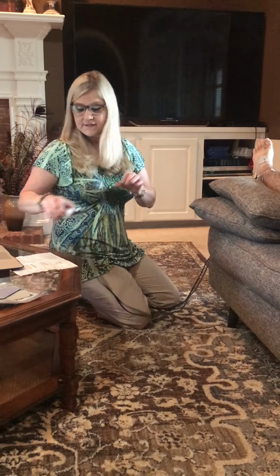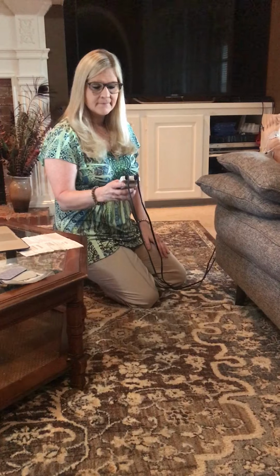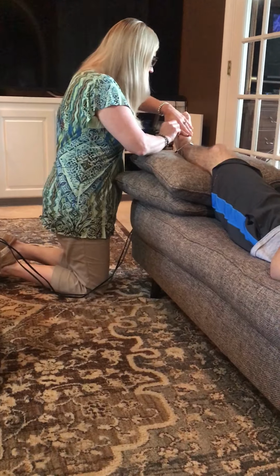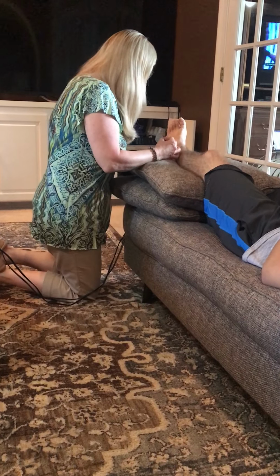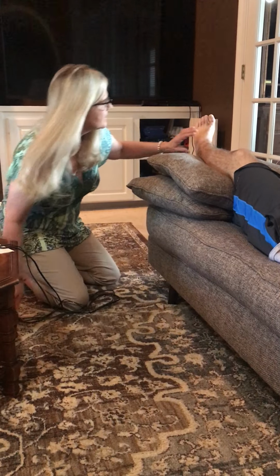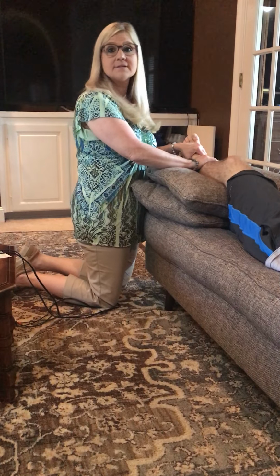So then leave him with the call button. Treatment's over. I'm going to turn the intensity down on my machine all the way to 0. And then off with my machine. I'm going to remove the electrodes. Okay. I'm going to clean and dry the area where the electrodes were and do all of my post assessments.